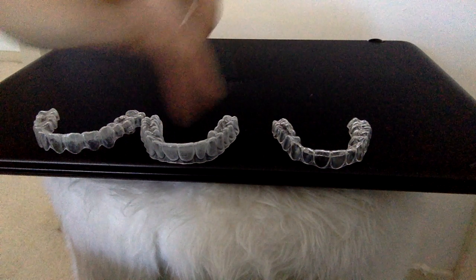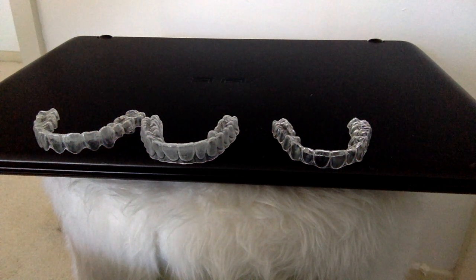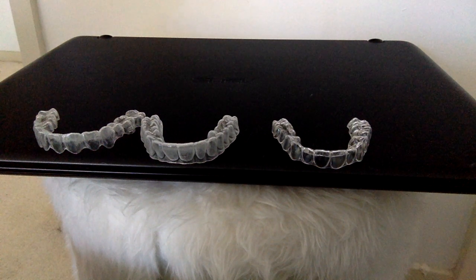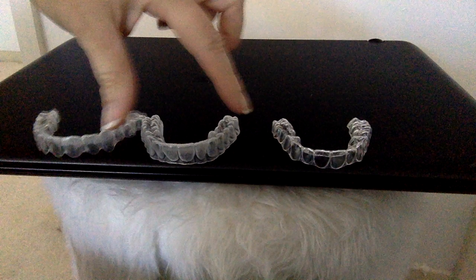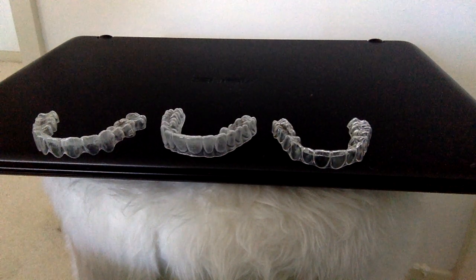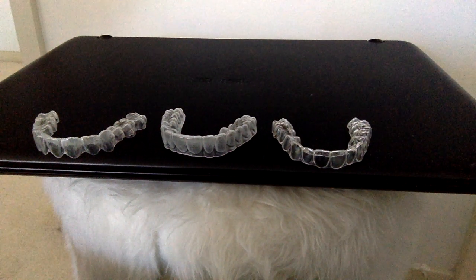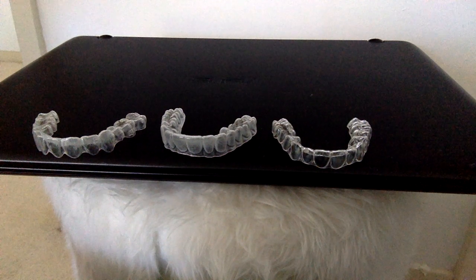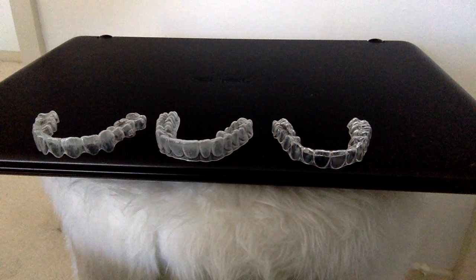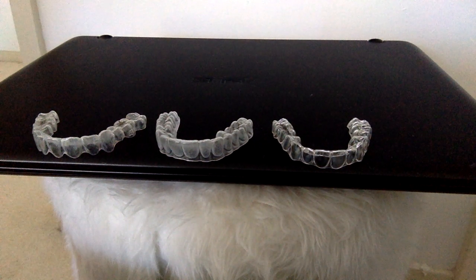This one, maybe it's more difficult to keep clean. So if you're not as good about brushing and flossing, maybe not a great option. But it moves teeth really well. Because of the high trim line on this one and the rigidity of this Zendura plastic, it moves teeth very efficiently when you wear them. It doesn't have a lot of forgiveness to get around mistakes with your impression. So I would highly recommend using a scan for this one instead of an impression, because any little error is going to be compounded because of the rigidity of the material.